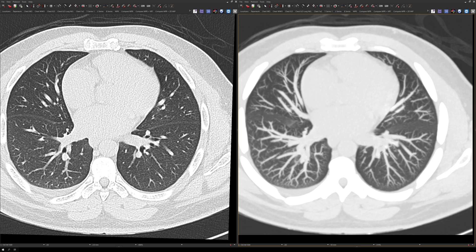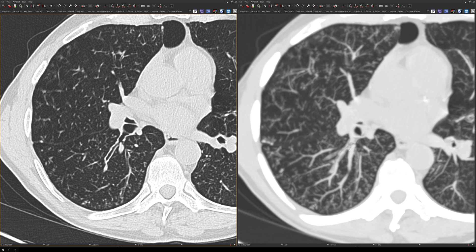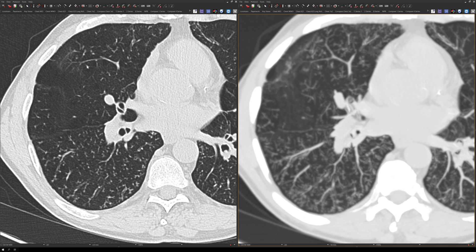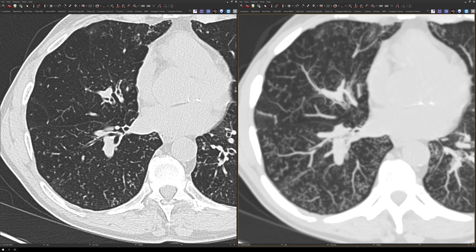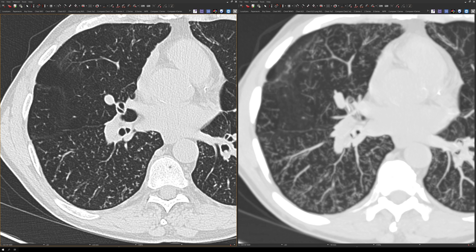Let me show you one other practical application of MIP images. In this example, the patient has a profusion of small pulmonary nodules. On the regular lung reconstructions with thin cuts, it may be difficult to tell the distribution of the pulmonary nodules. But with the MIP images, it effectively puts all the nodules in a 10mm slice thickness on the same plane, making the distribution easier to distinguish. On the MIP images, it's easy to see that these nodules are in a tree-in-bud distribution, whereas on the regular thin cuts it's not as obvious, especially if you're just starting out in chest imaging.